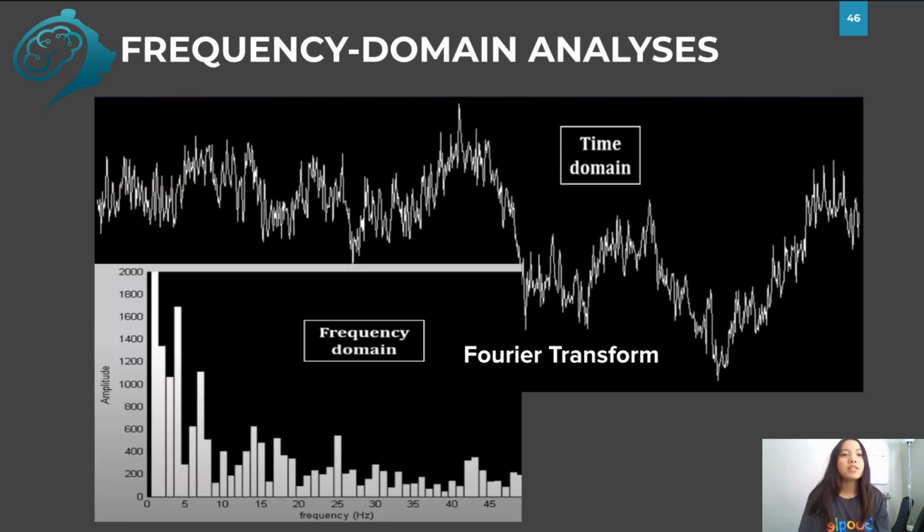So one of the main disadvantages of the Fourier transform is that it doesn't show us temporal information. All of the temporal information is actually in the Fourier transform, but in the phases, which are not generally shown. But from the results of the Fourier transform, it's difficult to determine exactly when different frequency components are present. So in this plot, we can say that there's such and such hertz component in the signal, say like 8 hertz or something.